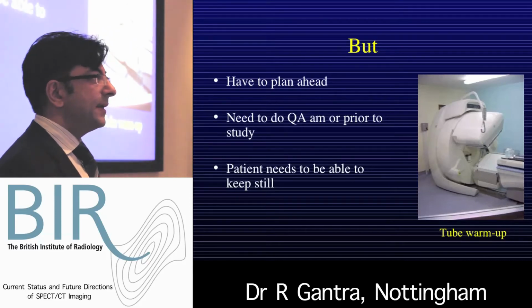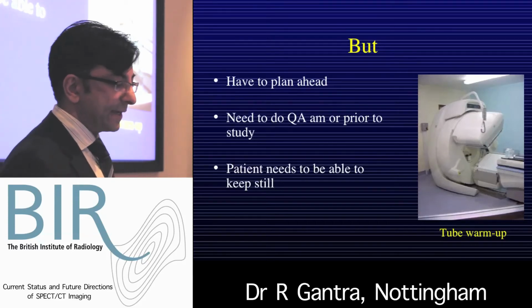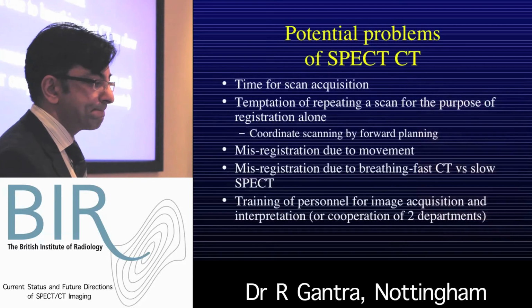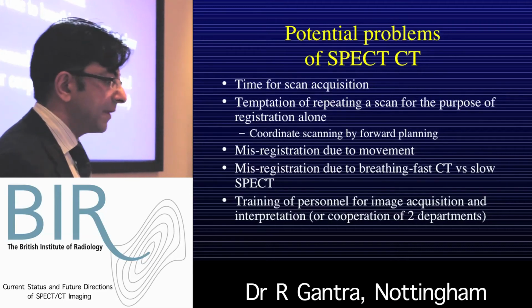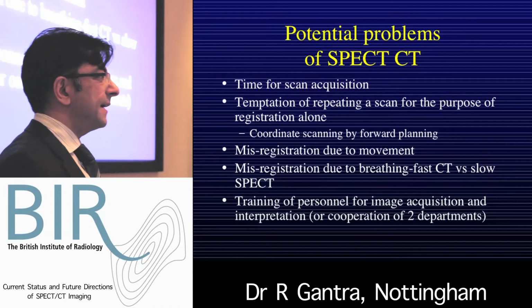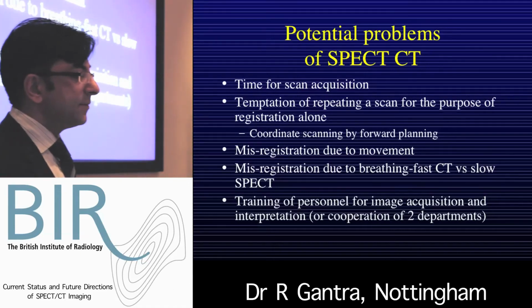The patient needs to be still. If the patient's moving around, there's little point in even attempting a SPECT CT acquisition, because that co-registration just won't be there. What about problems? Well, there are problems. There is a time penalty for doing the scan. There is a temptation, because you have SPECT CT, to do it. The patient's there, you have a machine.